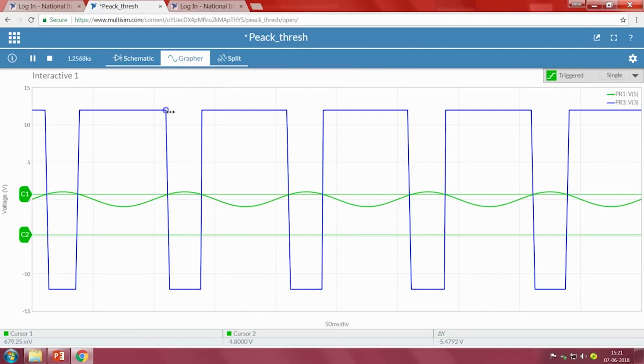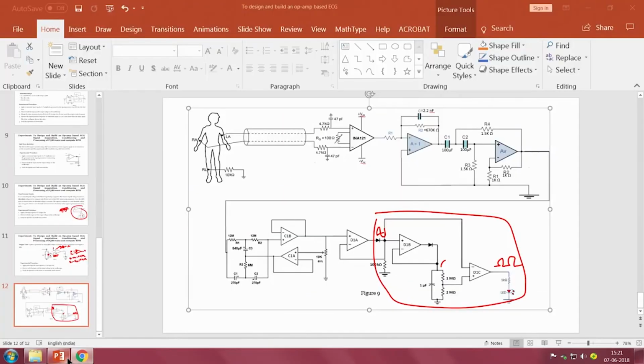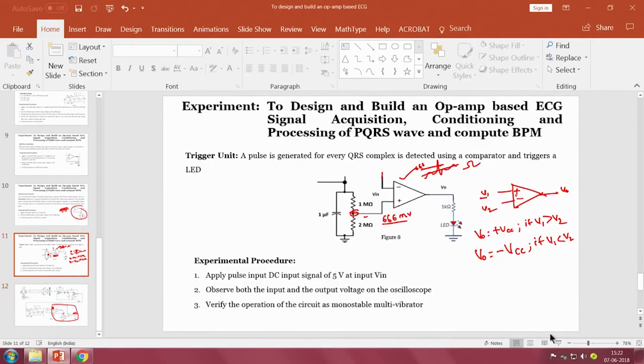The reason why, because we have used positive input. Here if you observe, the negative terminal is connected to here, whereas the positive terminal is connected to threshold. Now when we recall our comparator working, one thing we are sure that the output will be higher only when the input signal is greater than this particular value, right. That is what we have seen in the calculation.